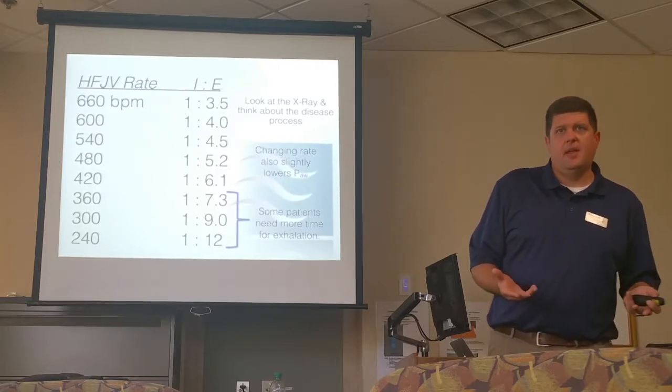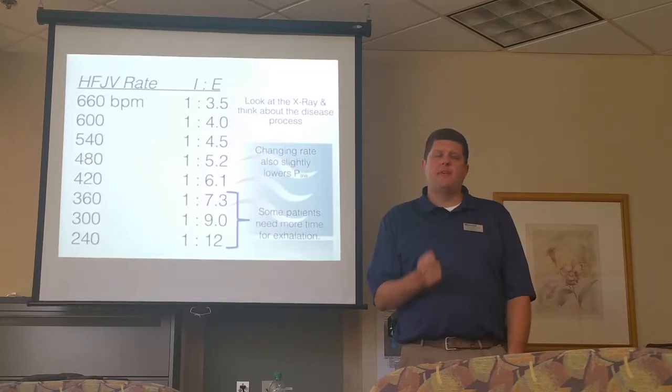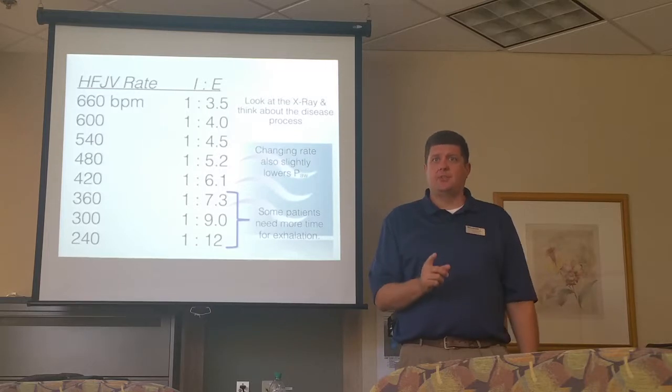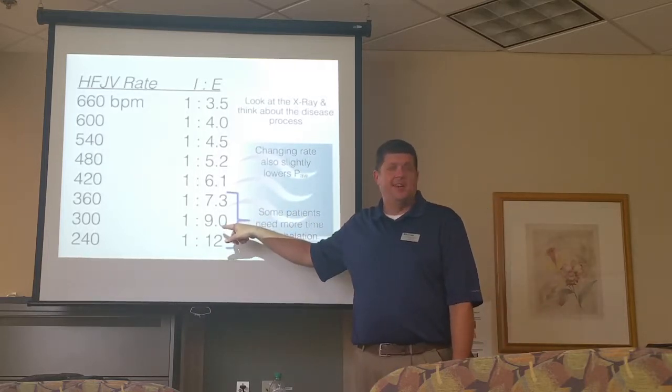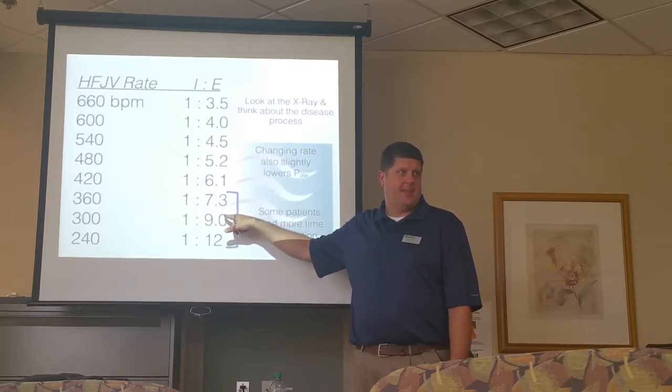Look at your x-ray. Ask a yes or no question. Would your patient benefit from a longer exhalation time? Yes or no? If the answer is yes, then being at a lower jet rate is a good idea. You get a longer IE ratio, more exhalation time, okay?